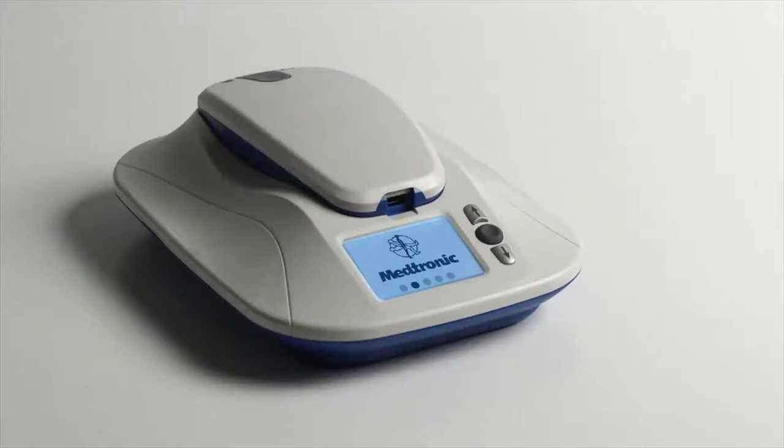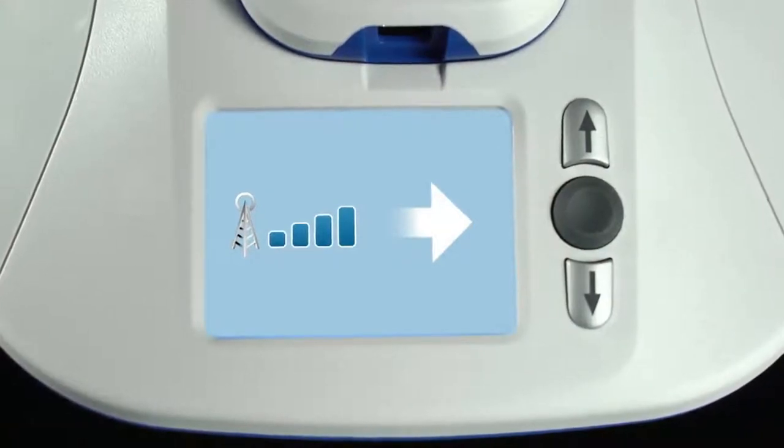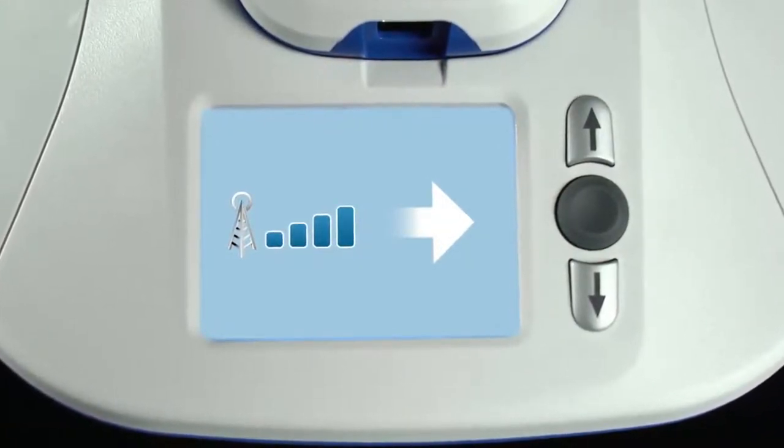After you plug in the monitor, the Medtronic logo will appear for a minute or two while it powers on. Then you should see an icon indicating the monitor is connected to a cellular network. Although the MyCareLink monitor will automatically send your heart data on a regular basis, a single manual transmission is needed as part of the initial setup process. This setup transmission is needed only once — even if you unplug the monitor later to move it or take it on a trip, you won't have to perform another setup transmission. After setup, there may be times when your doctor requests a manual transmission, but otherwise you should leave the monitor undisturbed as much as possible to avoid interrupting any automatic transmissions or software updates.